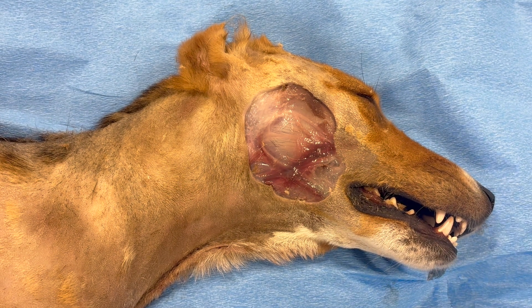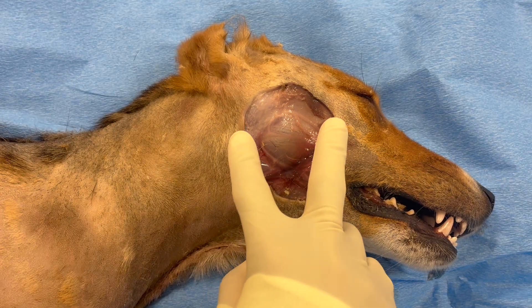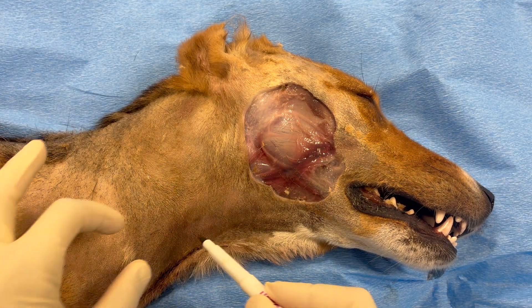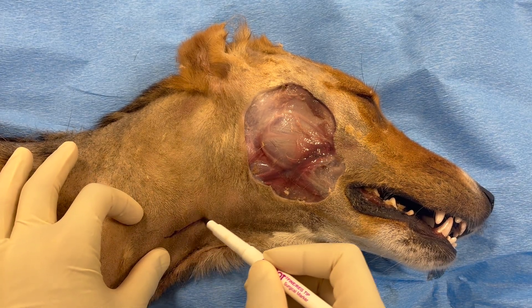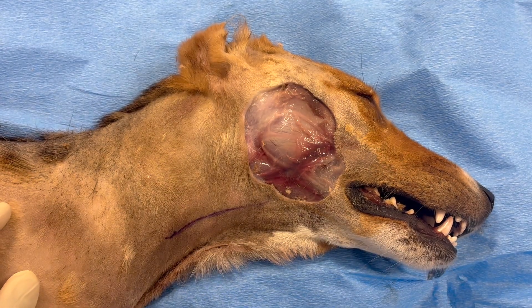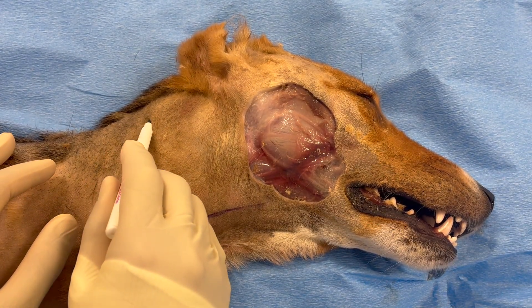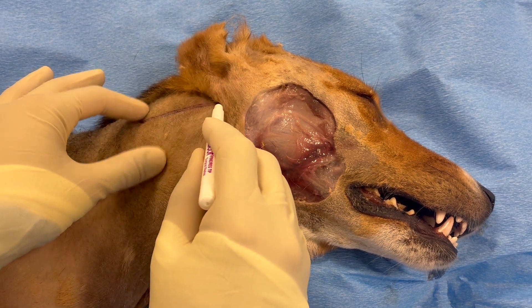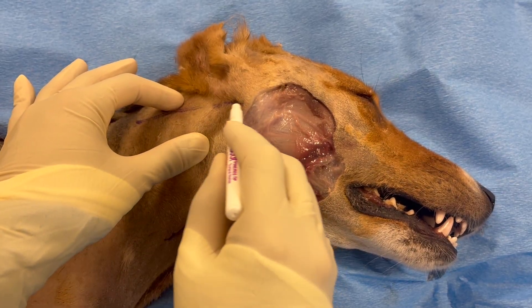We're going to create two parallel to slightly converging incisions that are approximately the same width from ventral to dorsal as the wound, and the length of these incisions is going to be approximately the same length as the cranial to caudal extent of the wound.